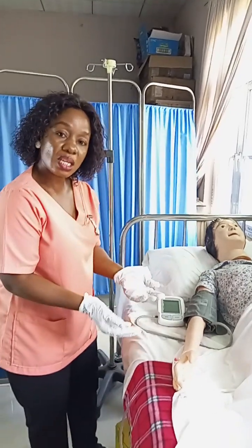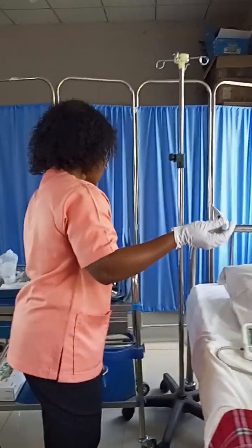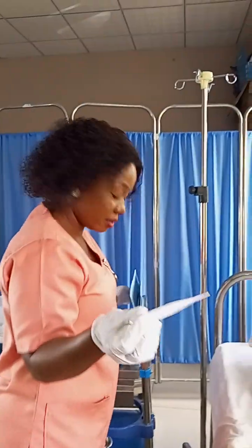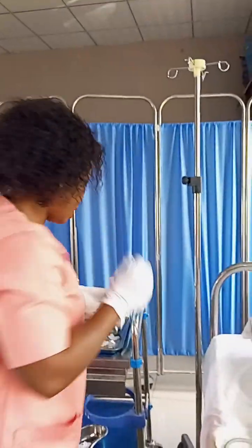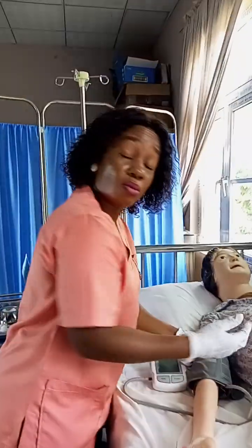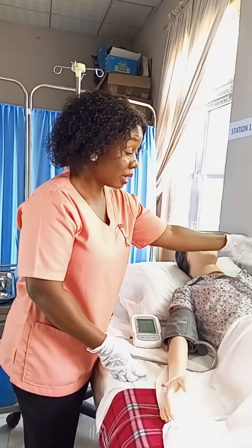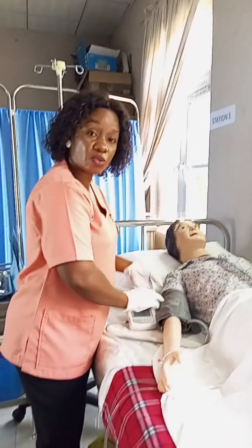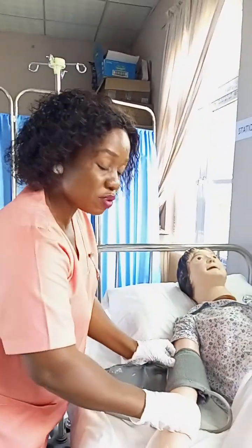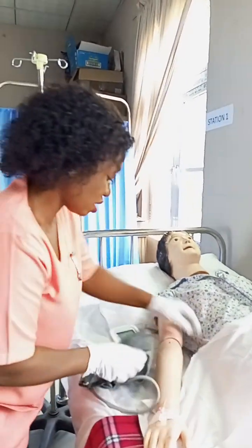So you have taken the patient's vital signs before transfusion. Then you remove the thermometer, clean it with a swab, discard the swab, and replace it inside its container. The next thing is you can choose to leave the BP apparatus, especially if you are using the distal hand, so that you can monitor the patient during blood transfusion. Permit me now to remove this BP apparatus, because I'm going to use this hand to transfuse the blood.